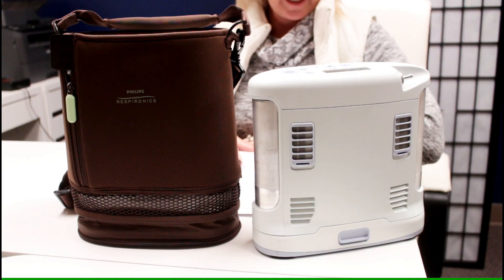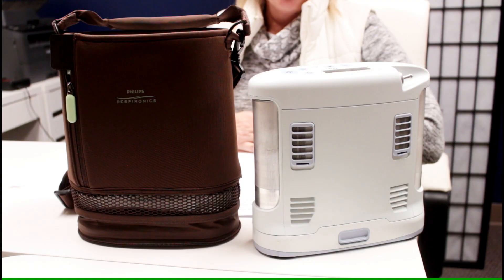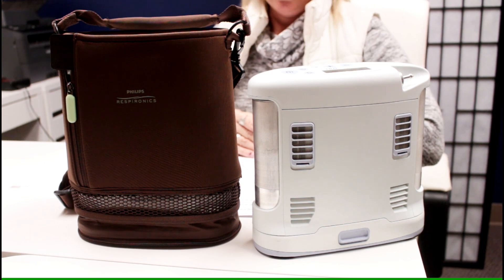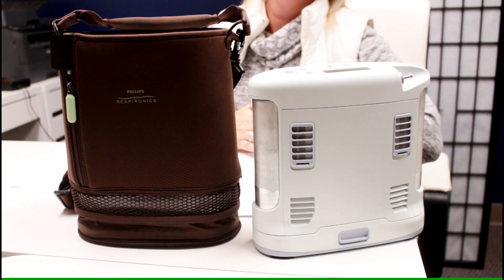Another consideration is how much air does the concentrator deliver in a continuous flow. They range from anywhere between half a liter to three liters per minute of continuous flow. Also consider how much airflow the concentrator delivers in a pulse flow — this varies by model. The majority of portable concentrators sold today can deliver up to six liters per minute in the pulse flow settings.